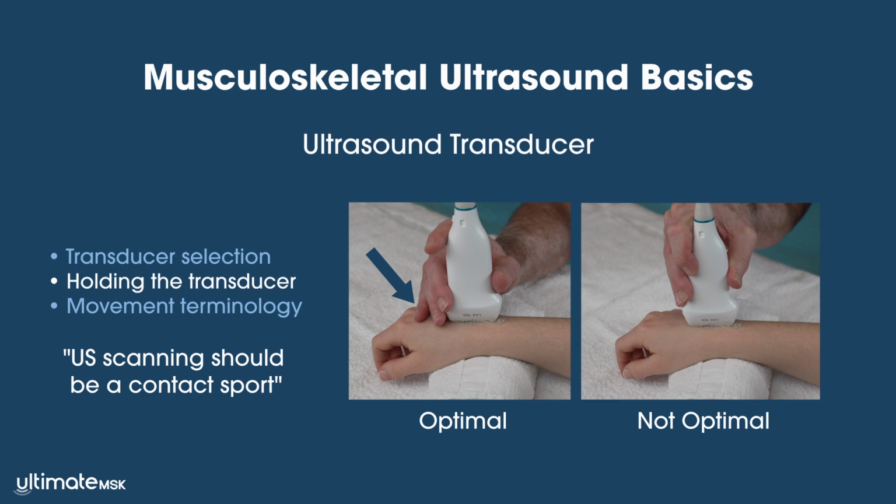This principle is not only important for diagnostic imaging, but also for ultrasound-guided injections or procedures. Using the hand to provide a stable base for the transducer minimizes movement, which is key for tracking a needle or other instrument accurately.